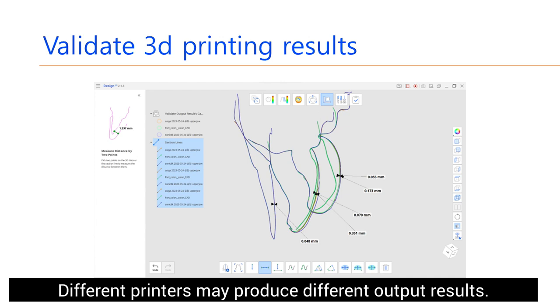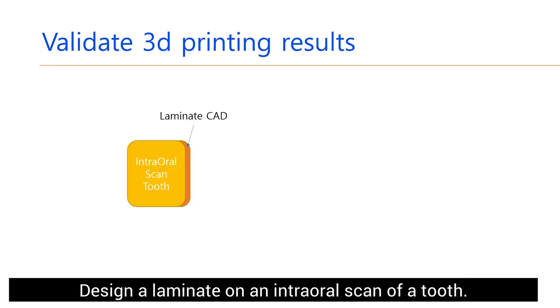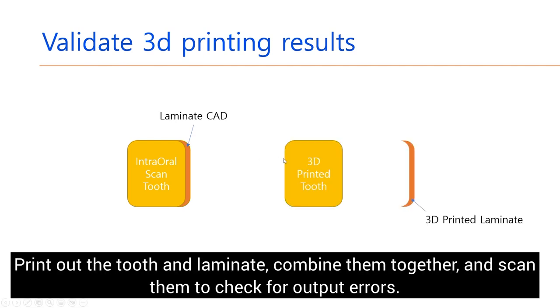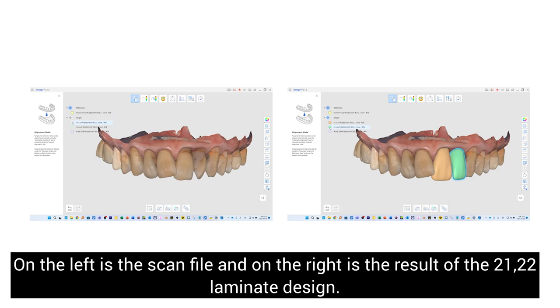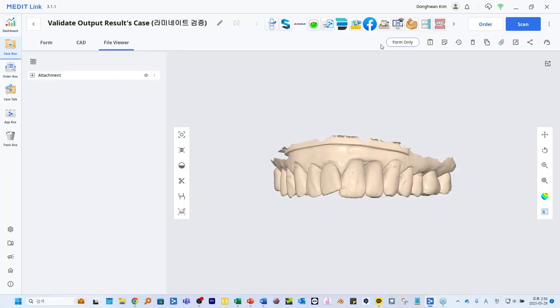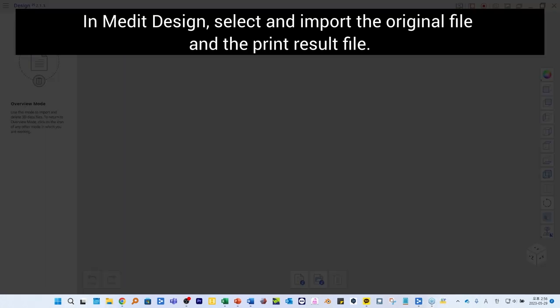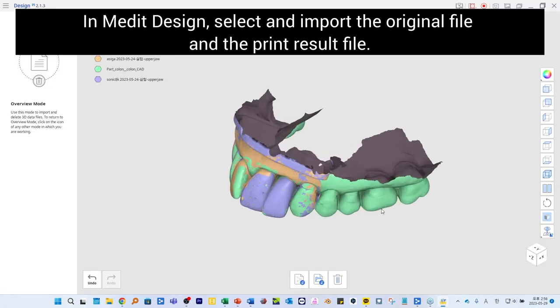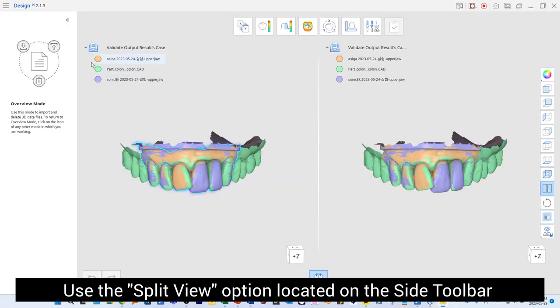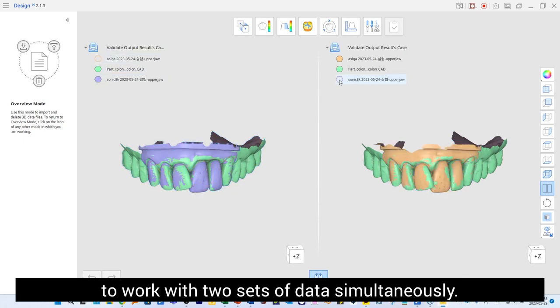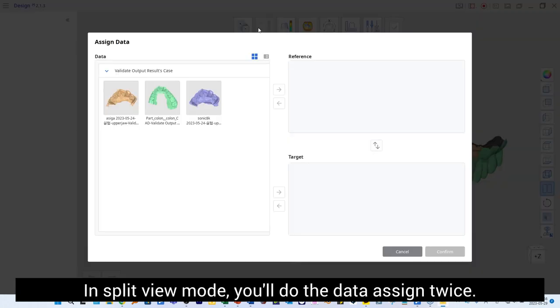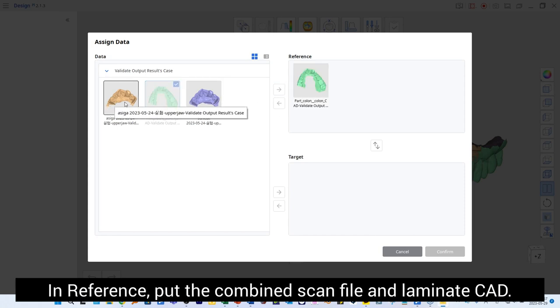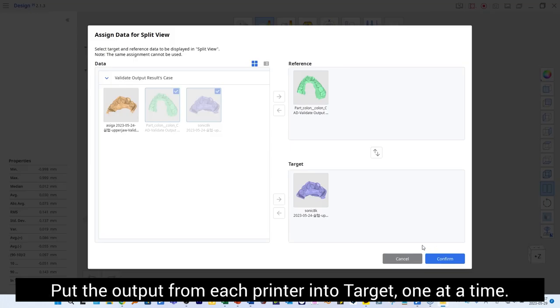Design a laminate on an intraoral scan of a tooth, print out the tooth and laminate, combine them together, and scan them to check for output errors. On the left is the scan file, and on the right is the result of the 21 and 22 laminate design. Run the Medit Design app, select and import the original file and the print result file. Use the Split View option on the side toolbar to work with two sets of data simultaneously — this option is available during Overview and Deviation Display modes. Select Deviation Display mode in Split View and assign data twice: in Reference, put the combined scan file and laminate CAD, then put the output from each printer into Target one at a time.